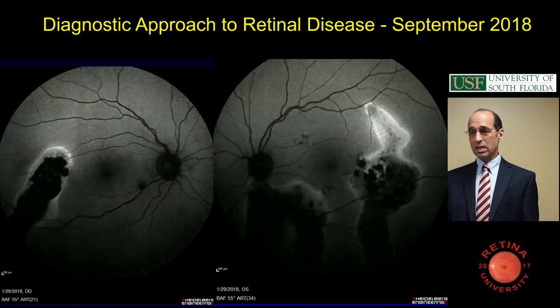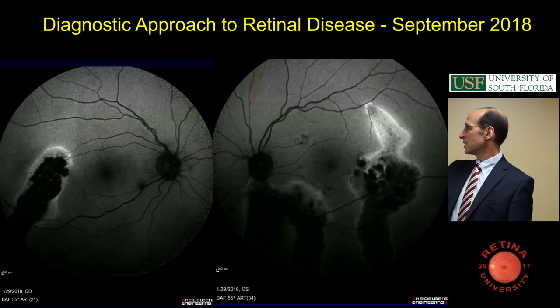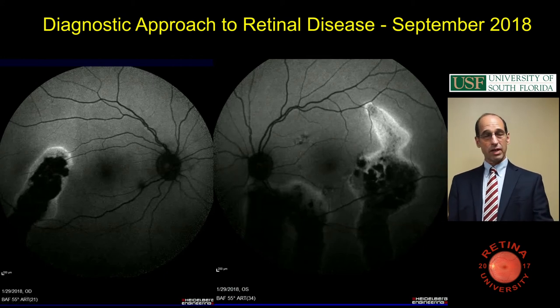And then this is a patient who was sent to me with unusual macular OCT. They did the OCT in the left eye, and the patient I don't think was symptomatic, but had funny looking tests. The color pictures were very subtle, and I was thinking, oh my gosh, the differential is pretty long for this patient, all sorts of dystrophies and stuff.